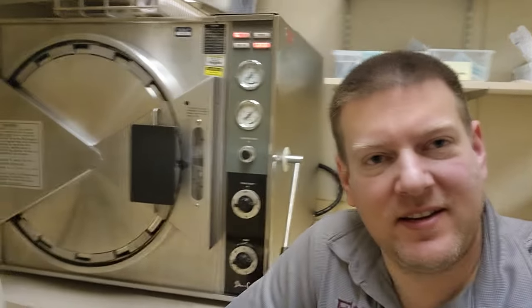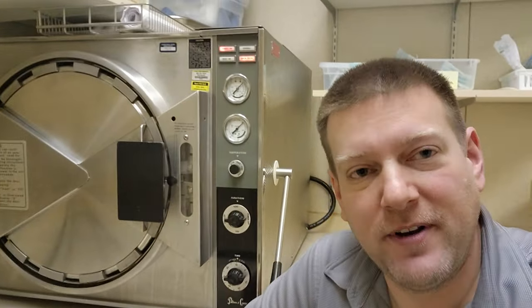Hey everyone, welcome back to Bitter Biomed. If you guys have been watching my videos, you probably realize that this guy here was recently in another video where the plug had caught fire.